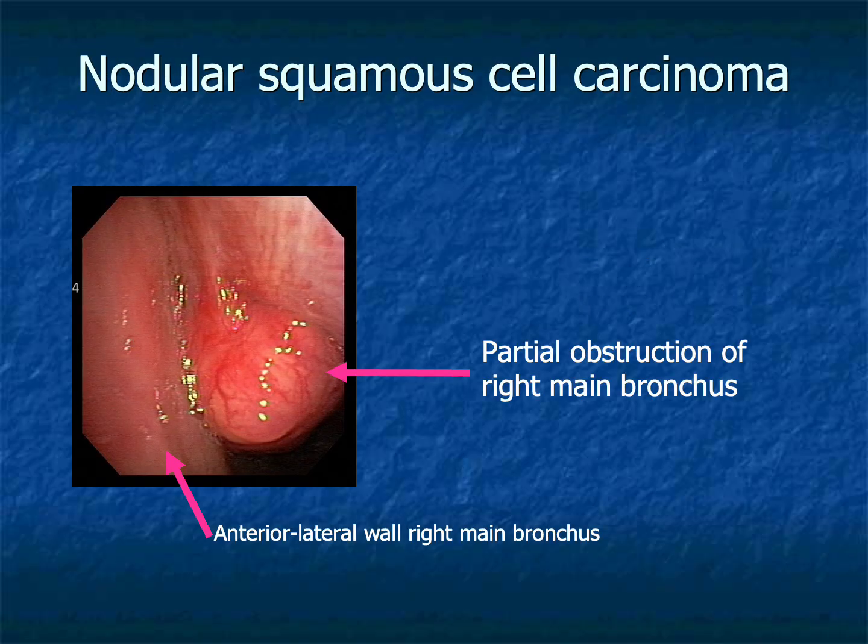Squamous cell carcinoma frequently presents as a nodular lesion projecting into the airway lumen. The lesion may appear irregular, friable, and can be highly vascular. Documentation should include the site of origin, degree of obstruction, extent of mucosal involvement, and any associated bleeding.